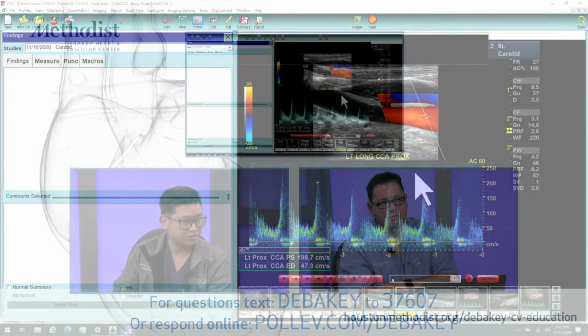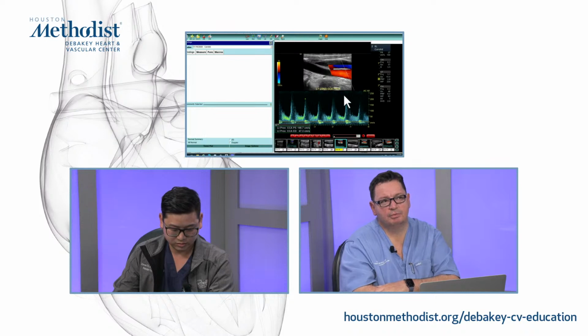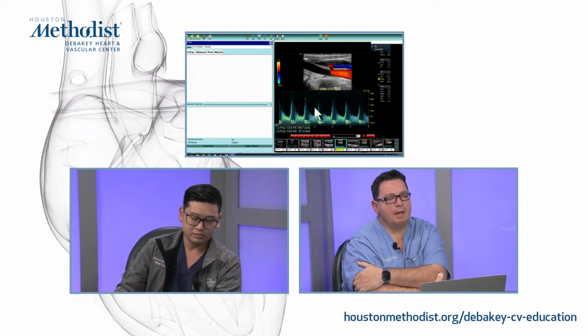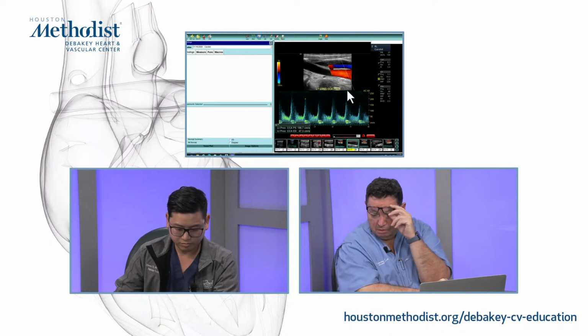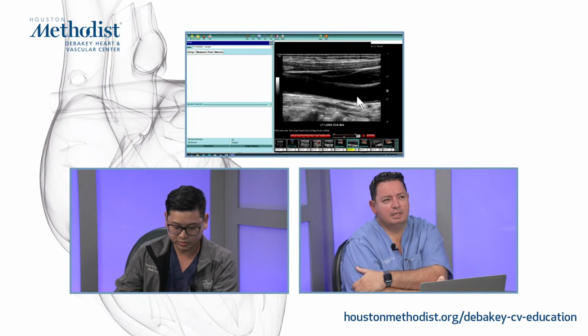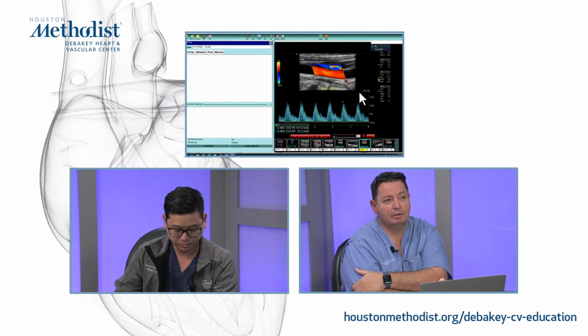So you can tell the difference between, again, your right and left side, but you have some bruit on top of your increased velocity. Yes. So I would say that this is a beautiful compensatory flow. If you show me a mid part, also maybe elevated. All right, let's see. Smooth intimal linings. Yeah, here. Yeah, definitely smooth. The velocity is not increased because you have a stenosis. So this is probably a nice hyperemic compensatory flow. Mhm. Yeah, absolutely.